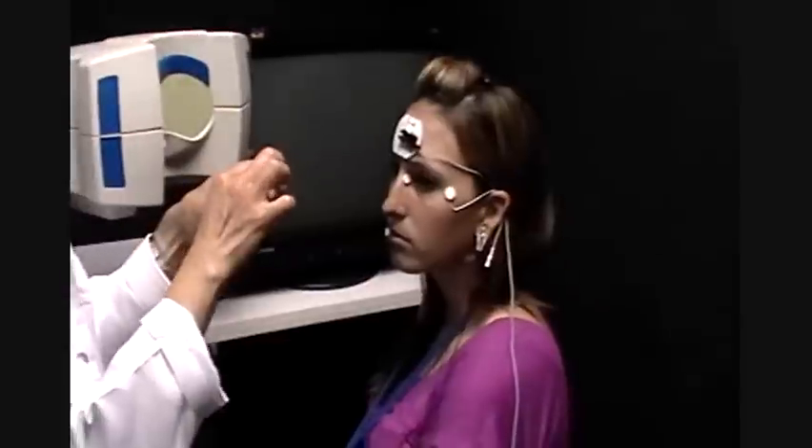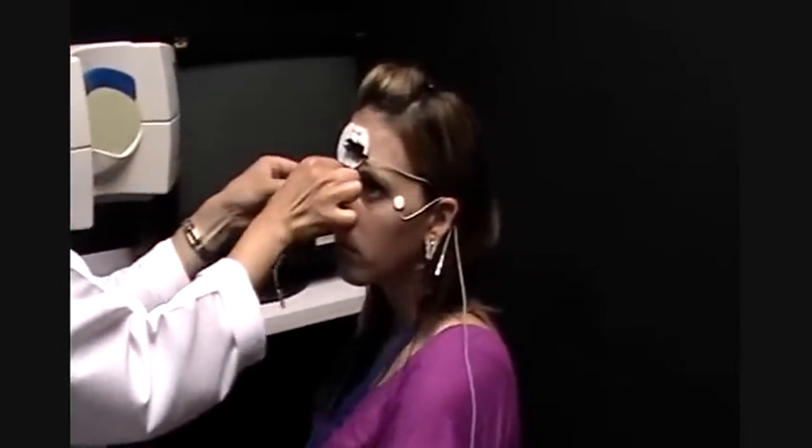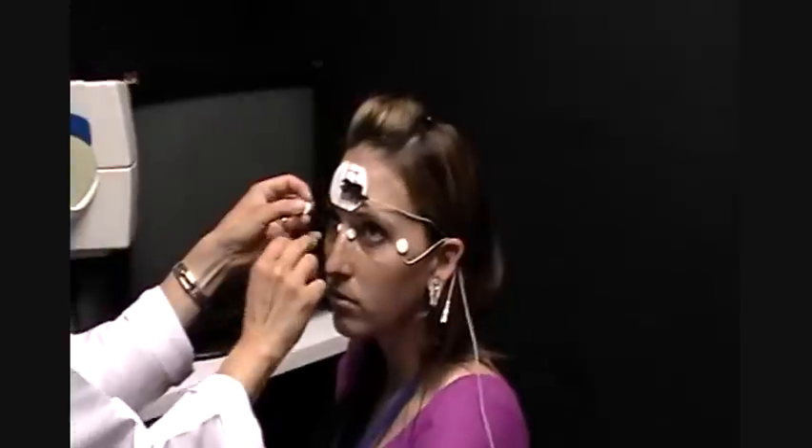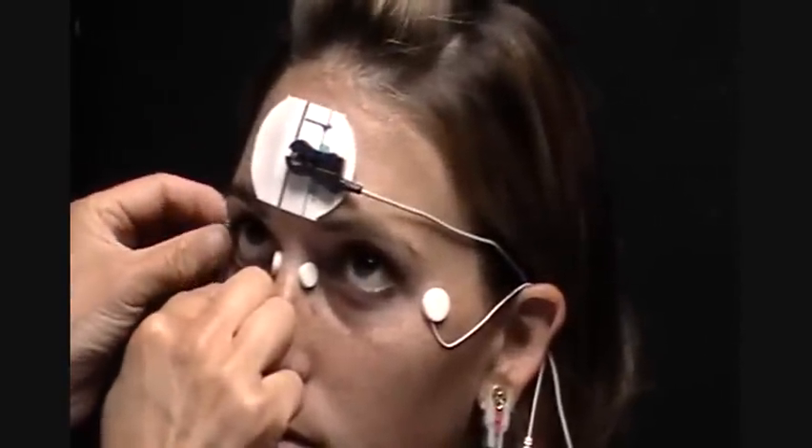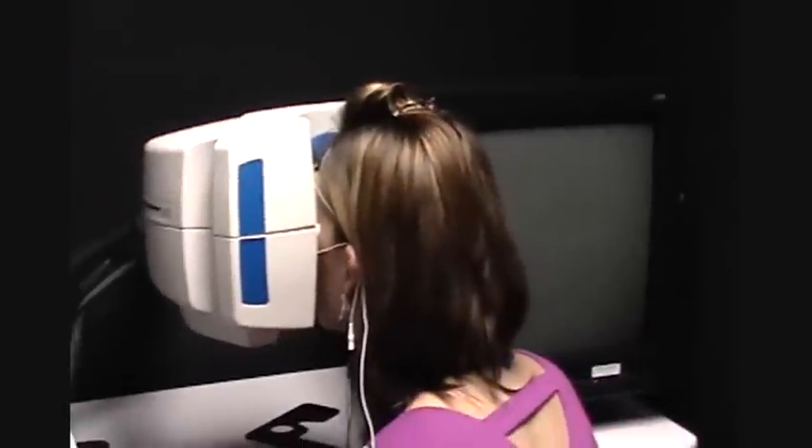We're going to inner canthus. Look up, Allison. It lies right there, and she's ready to begin. She places herself at the Gansfeld, and this is the extent of this. Very easy. Thank you.